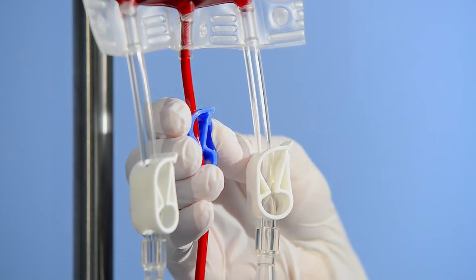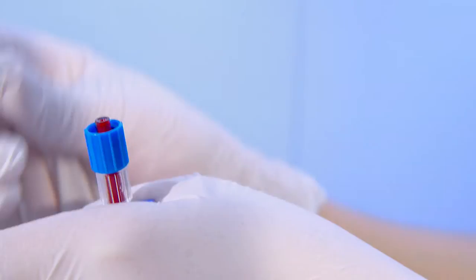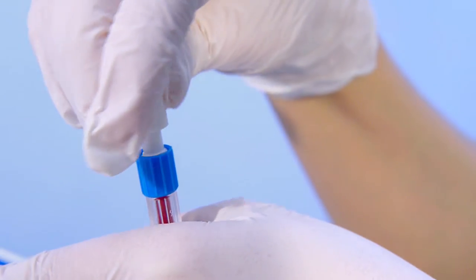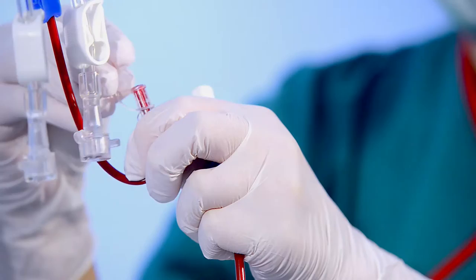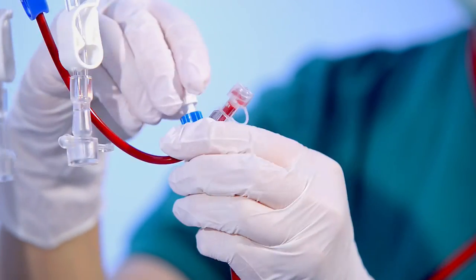Close the blue clamp at the PRC bag to avoid leakage. Disconnect the PRC bag from the reconnected AT3 set by separating the lure lock connections. The blue lure lock has to be removed from the transparent lure lock.